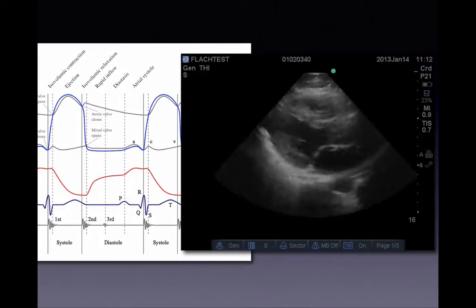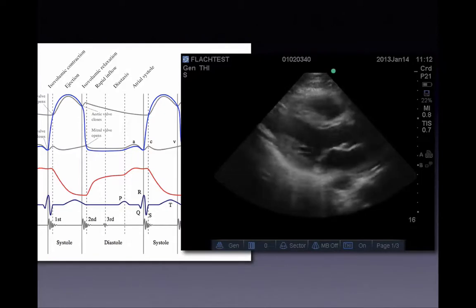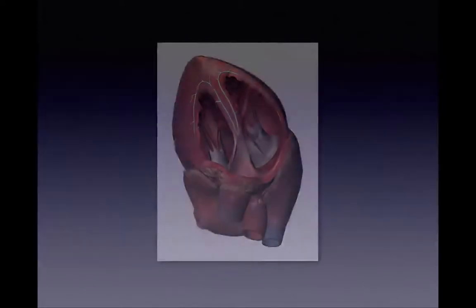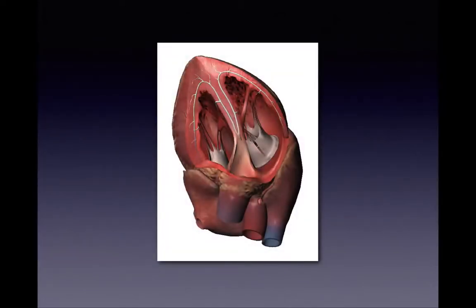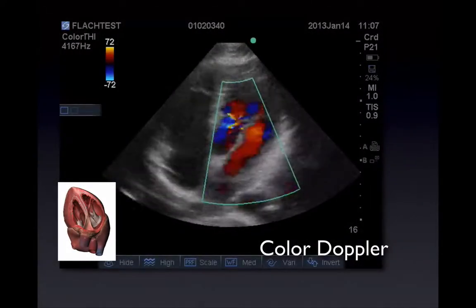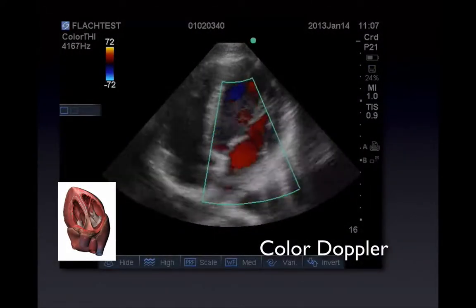You will get this. You're going to be able to get these. We just want to use ultrasound to help you understand all these concepts of anatomy and physiology. If you look at the heart, obviously you'll do dissections, but we want to show you how blood flows through the heart.